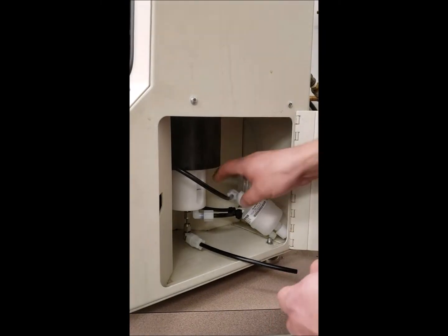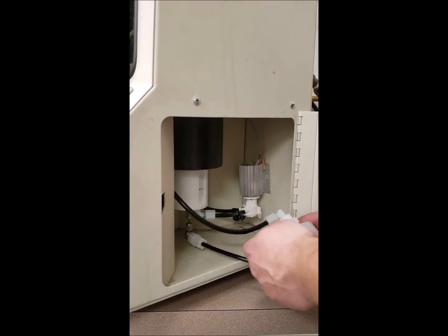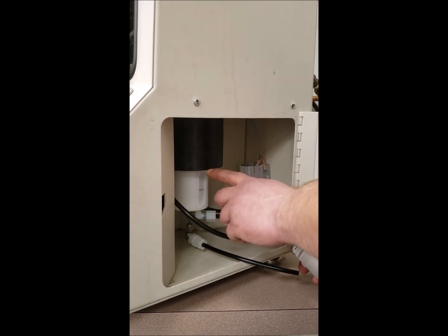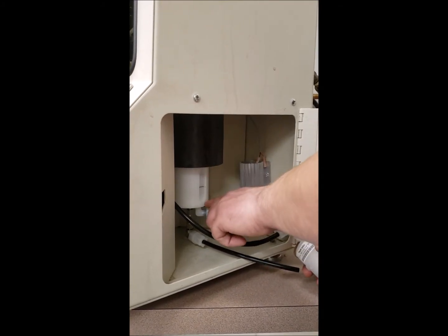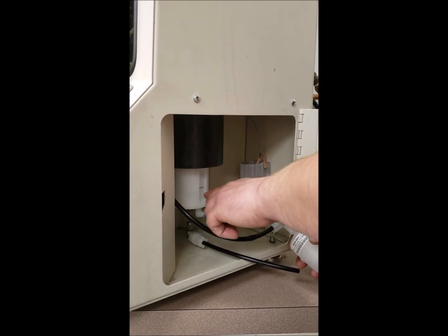First off, we're going to explain how the system works. You've got your coating bowl and your coating reservoir. You should always keep your reservoir filled about halfway.